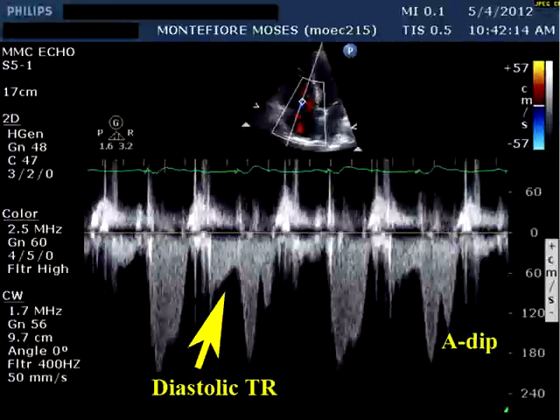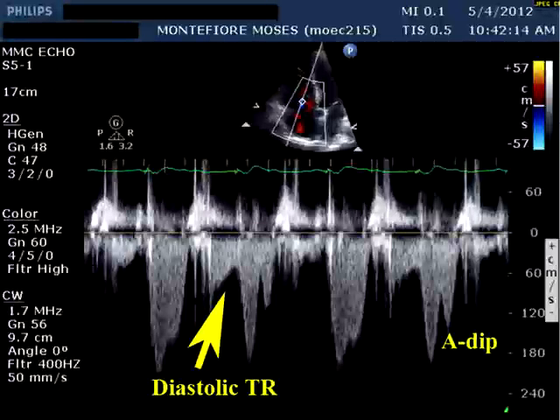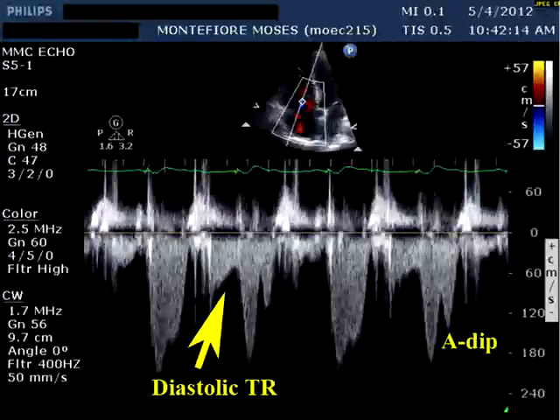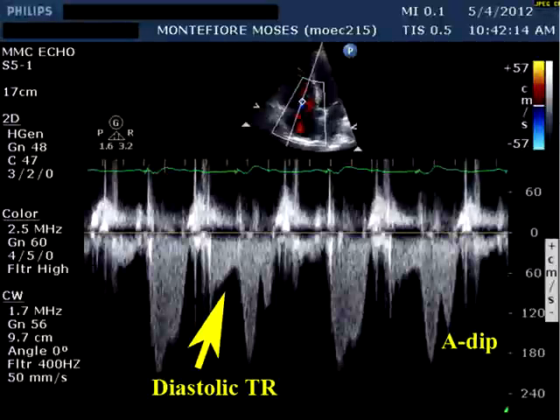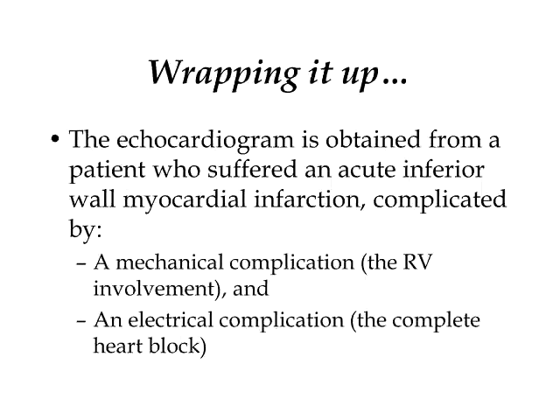In addition, there are periods where RA diastole is occurring without simultaneous RV systole, causing diastolic tricuspid regurgitation as right atrial pressure falls because of its own diastole. To wrap it up, this one echocardiogram demonstrates an acute inferior wall MI with both a mechanical complication — right ventricular involvement — and the electrical complication of complete heart block at the same time.